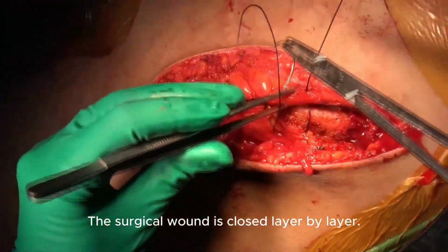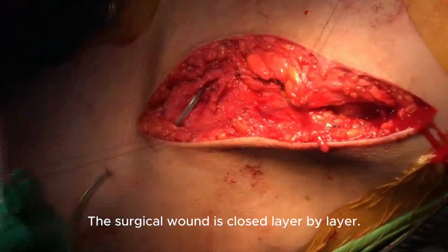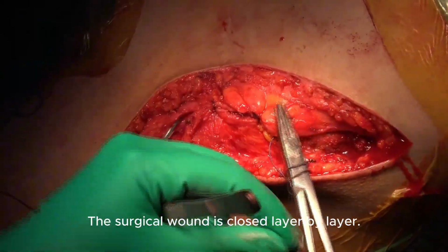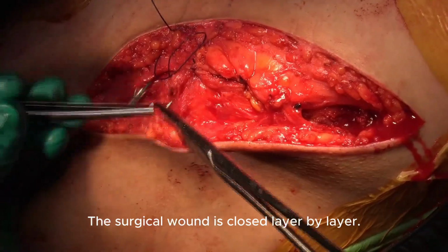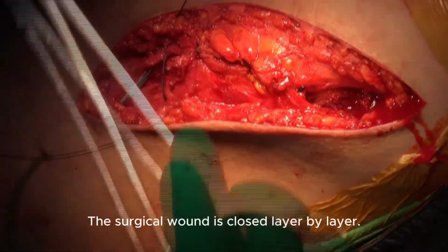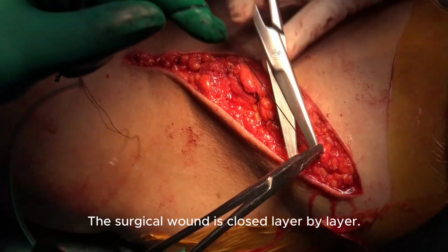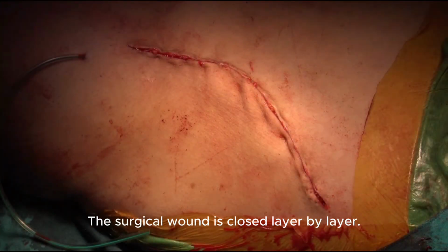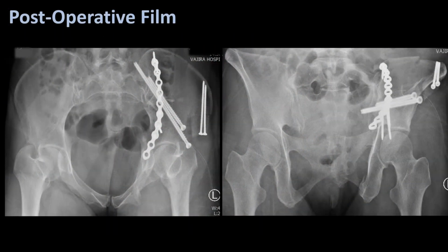The surgical wound is closed layer by layer. The postoperative film shows good alignment of the pelvic ring and well-reduced osteotomy site.